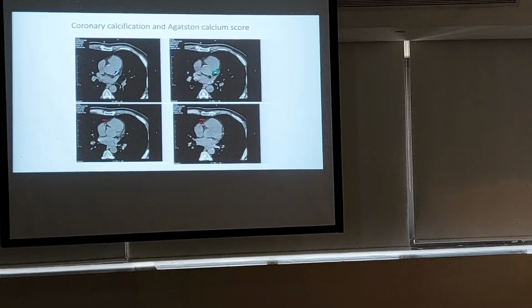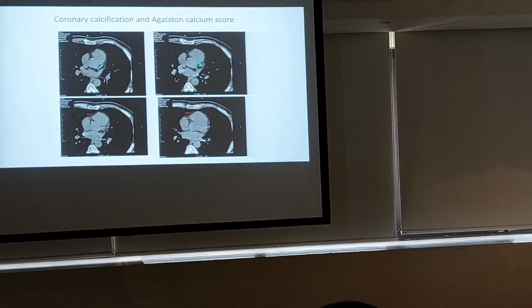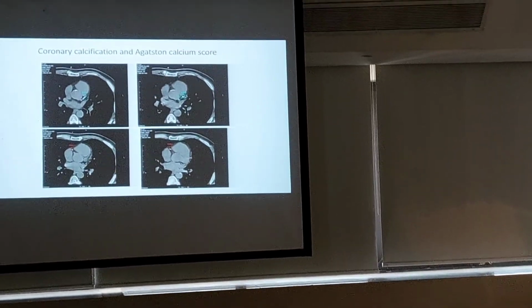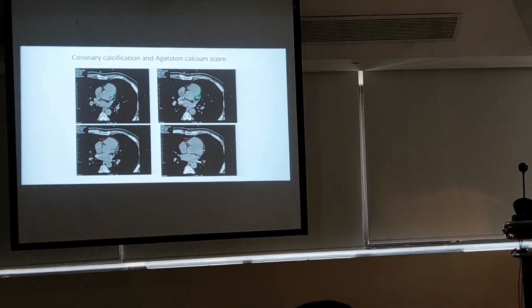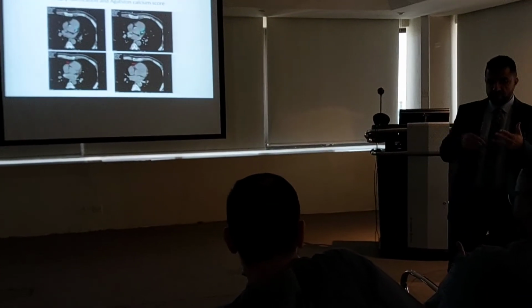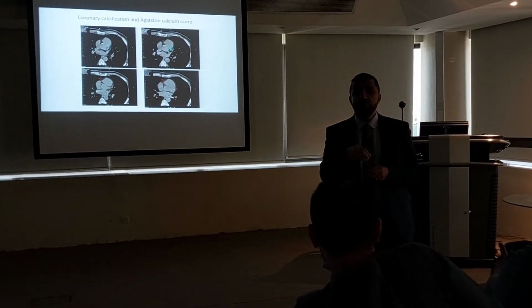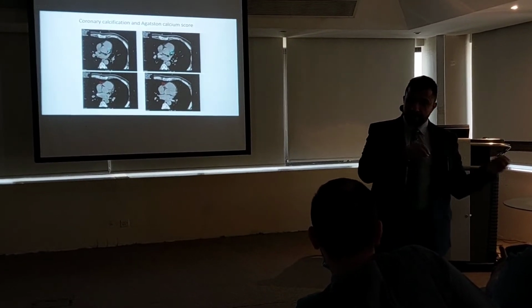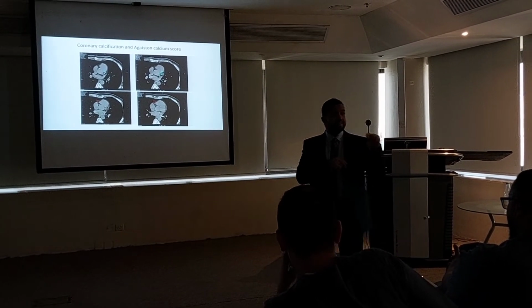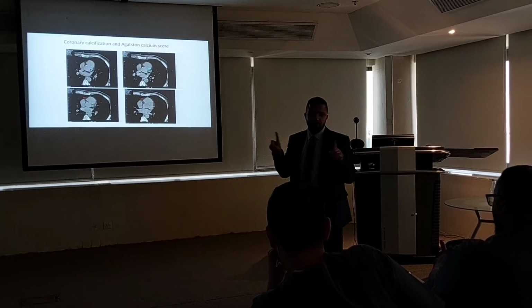And the breathing instructions are the same. So I should have almost the same heart rate as the main position. And in diastolic phase, gated, so as to get these images. So this is in diastolic phase with the same heart rate, with the same patient, so most probably I will get the same result in that position. Because of that, this is a very good indicator for me to check the motion of the coronaries.